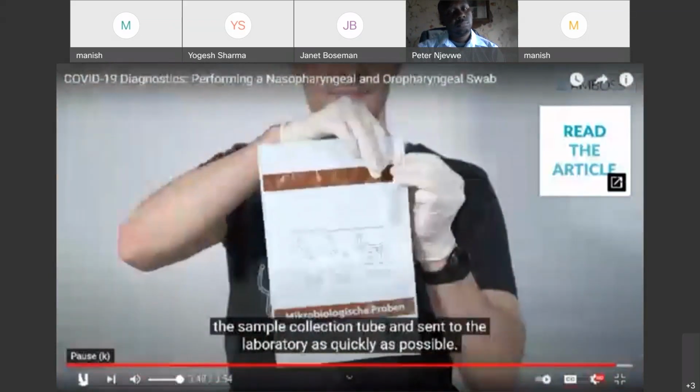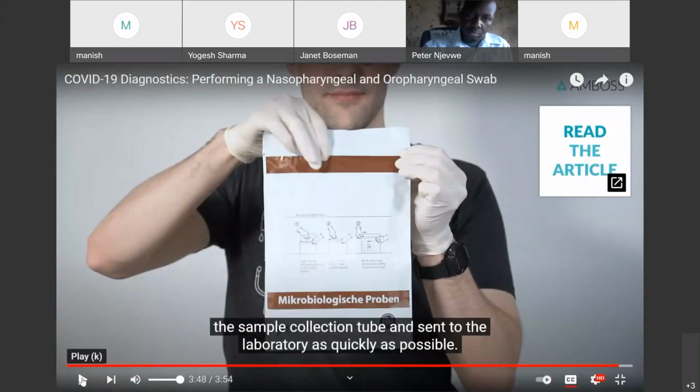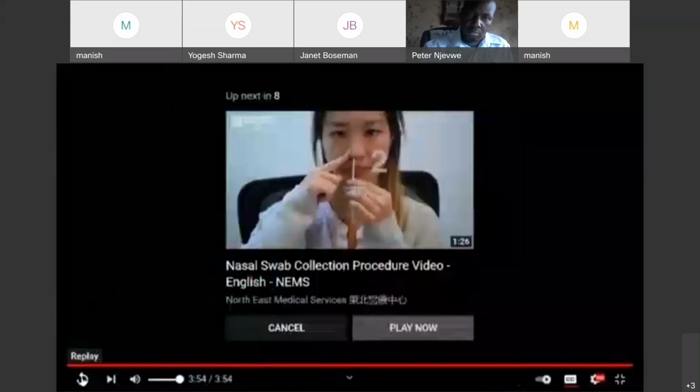And we have to close this back in this manner. We have to put the viral transport tube in a self-sealing bag. And this is the complete collection technique.